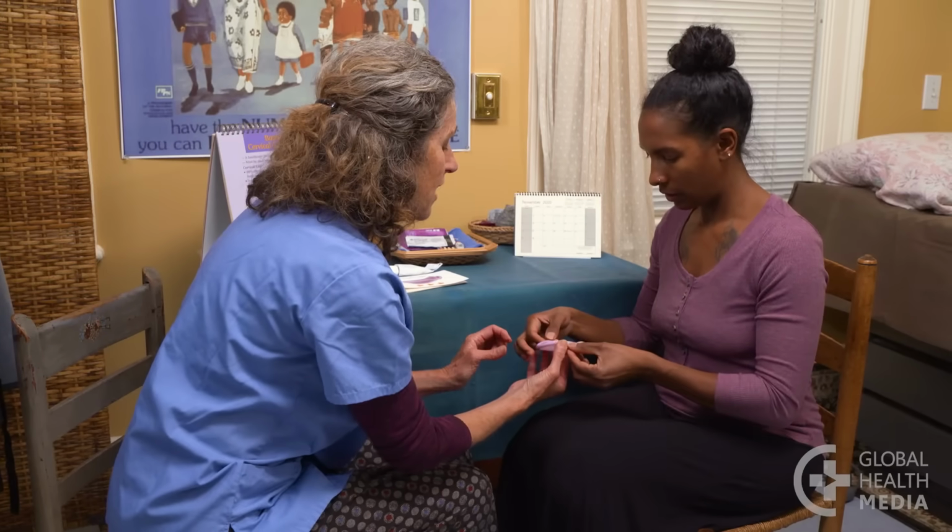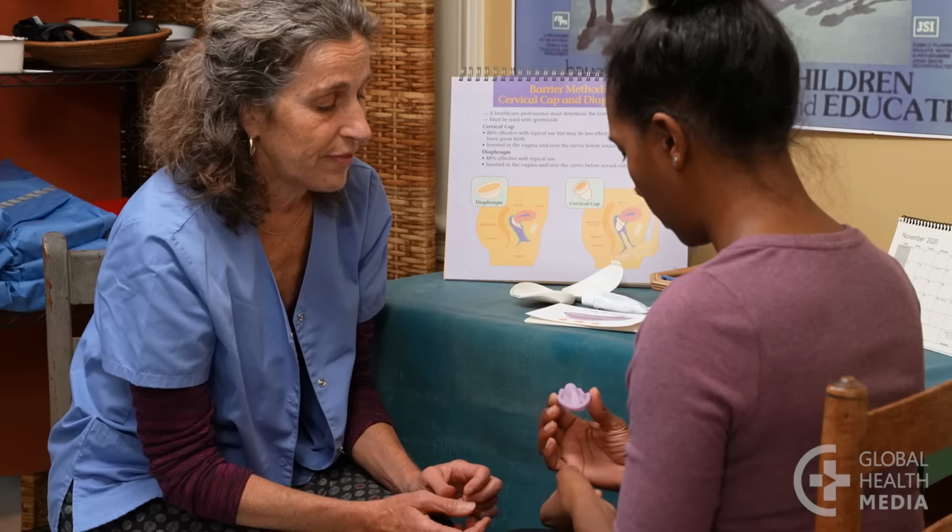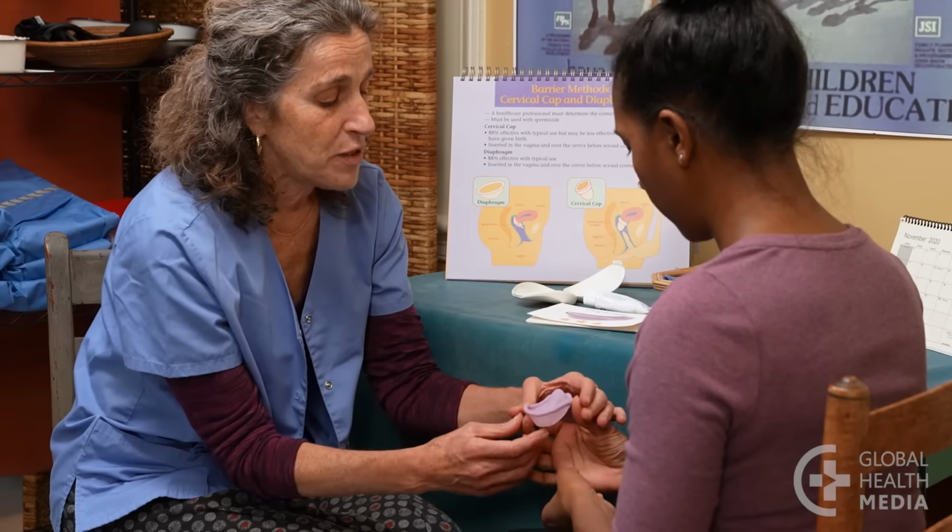It's easy to learn to use the diaphragm, but you need to be comfortable putting your fingers inside yourself. It comes in one size that fits most women. Practice putting the diaphragm in and taking it out until you're comfortable. This will give you the confidence you need when you are in the moment.